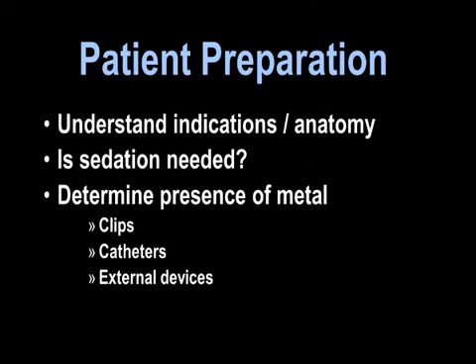Patient preparation: I have to say, in 25 years I've been doing this, the ball has shifted to dose reduction in the last 10 years, and I think that's why you're all here. But I think we're going to have a patient preparation conference at some point soon, because the mistakes I see come in as outside examinations now often are errors in poor sedation, overranging in scans, poor contrast enhancement, poor technique, and motion artifacts. Something should have been contrasted and wasn't. So these technical things, to me, have taken a back seat to dose control.